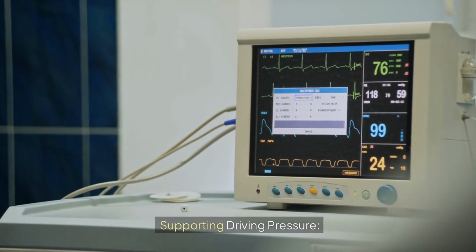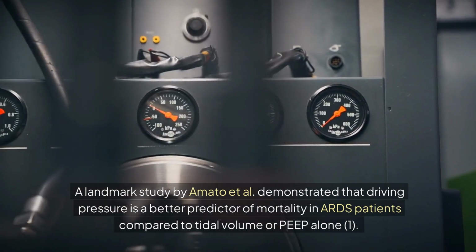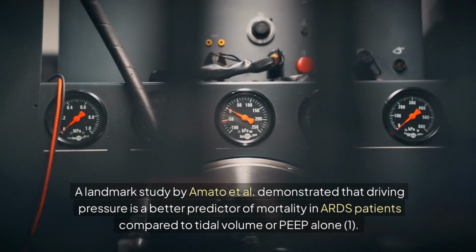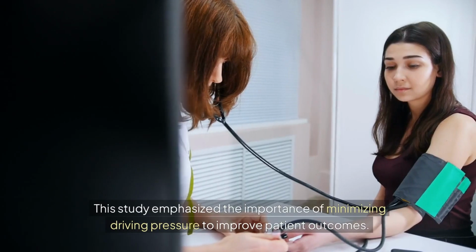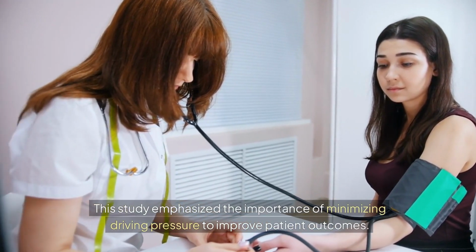Supporting evidence. A landmark study by Amato et al. demonstrated that driving pressure is a better predictor of mortality in ARDS patients compared to tidal volume or PEEP alone. This study emphasized the importance of minimizing driving pressure to improve patient outcomes.